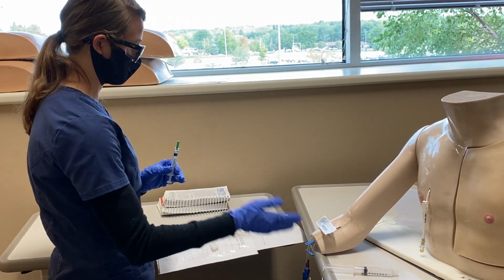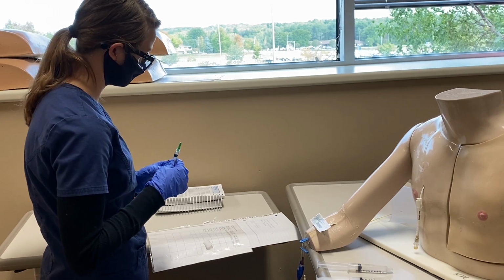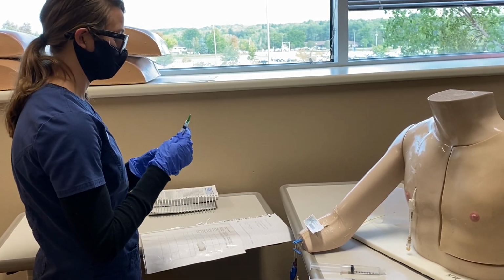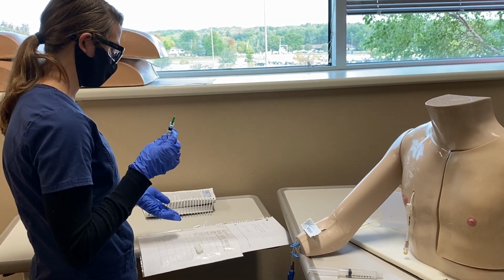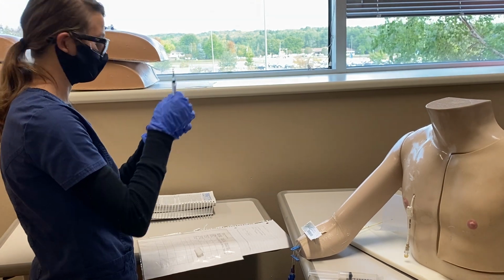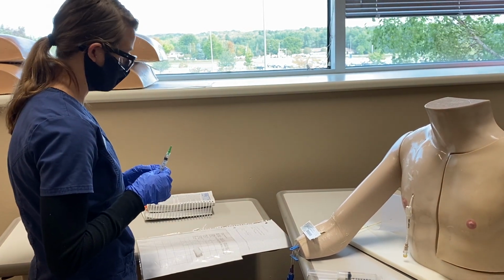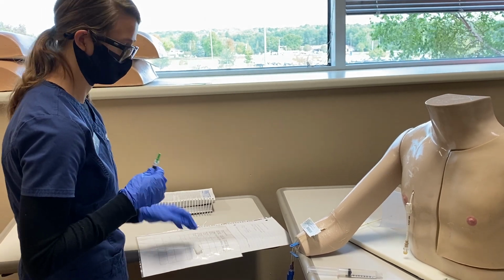Bob Owens, 9/22/1933. He will be getting hydromorphone because he's allergic to morphine. He is ordered 1 milligram. After doing the math calculations, he should be getting 0.5, which he is. He's getting an IV push, and he'll be getting it every 3 hours for pain.